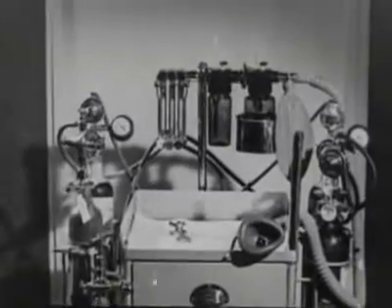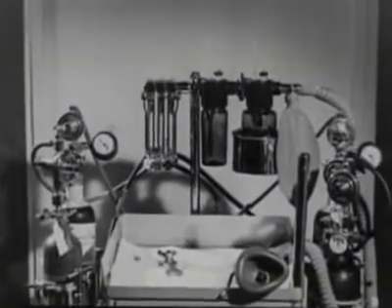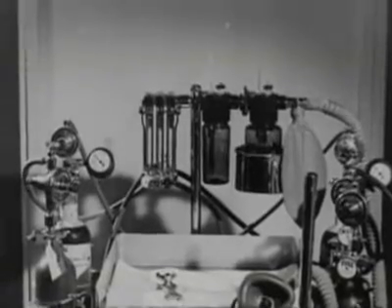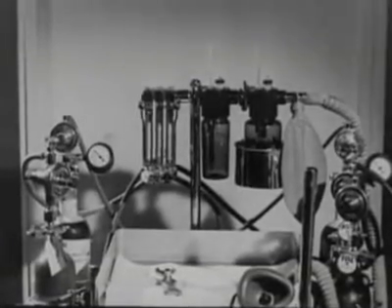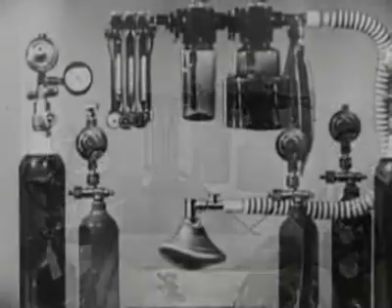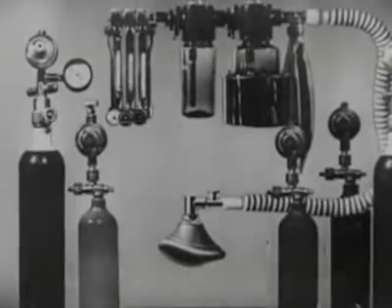This film explains the working of a typical apparatus designed to deliver a continuous flow of nitrous oxide and oxygen, to which ether can be added as required. This diagram shows the general working of the machine.